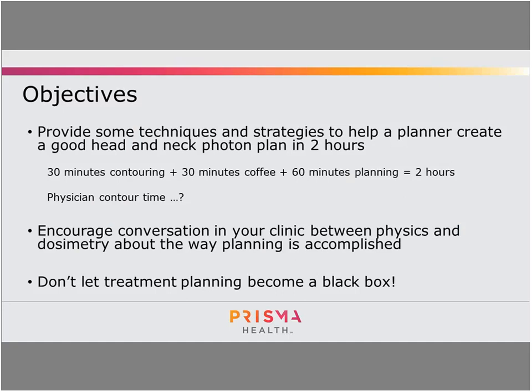That's in general 2 hours, but that does not take into account physician contour time, because that is a mystery. It could be anywhere from a very short period to days, and typically has a question mark next to it because you don't know when you're going to get them. I'd really like to encourage this conversation in your department between physics and dosimetry. It seems like the more you talk about it, you can refine things and end up with better quality.